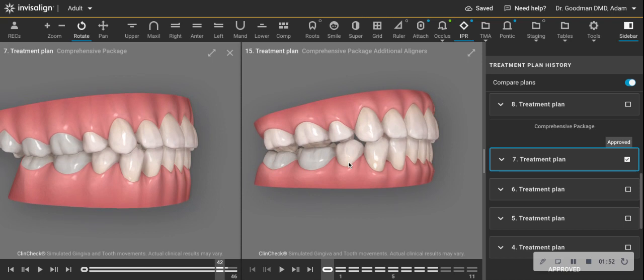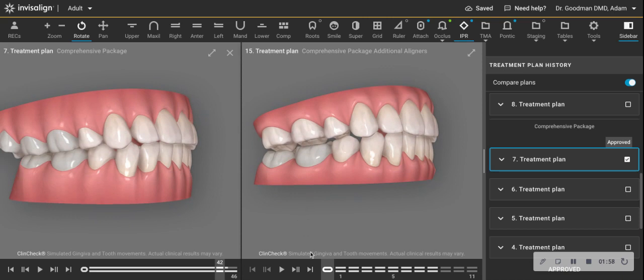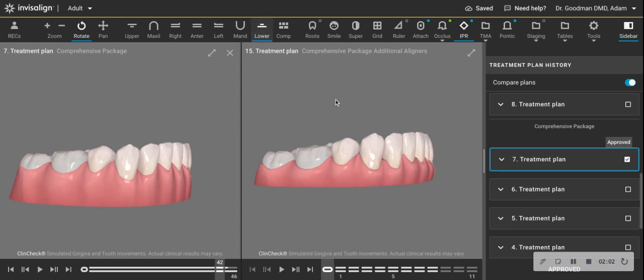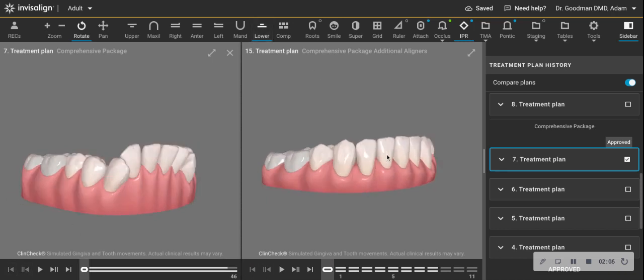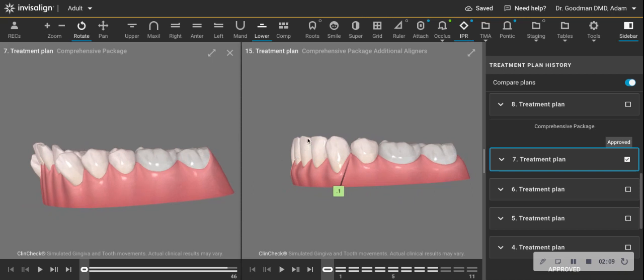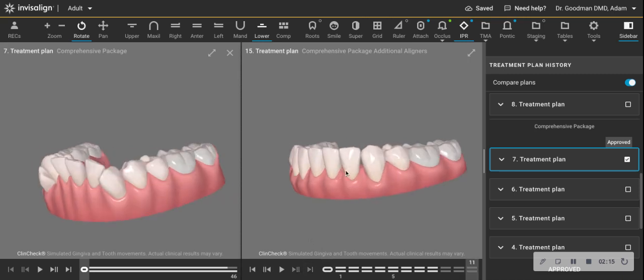And so you can see here this is my scan before the last refinement. I still have to improve that posterior occlusion a little bit, but look at the lower canine angulation before and after. And even here, if anything, there's still some mesial crown angulation to that.